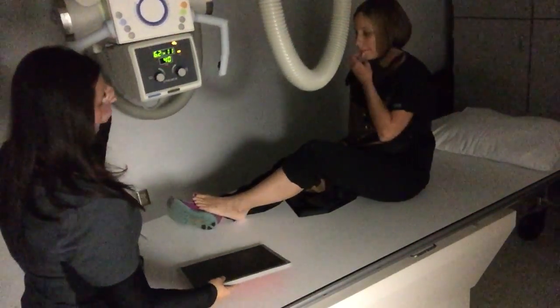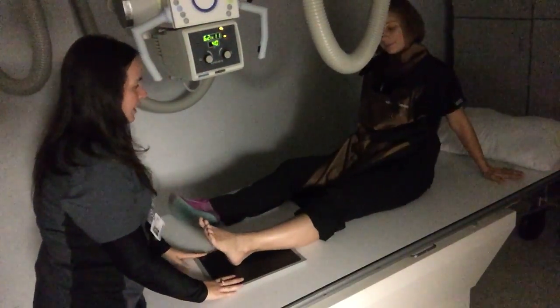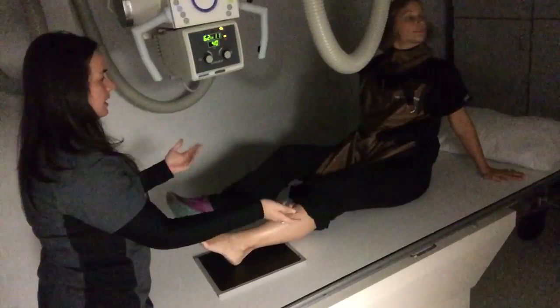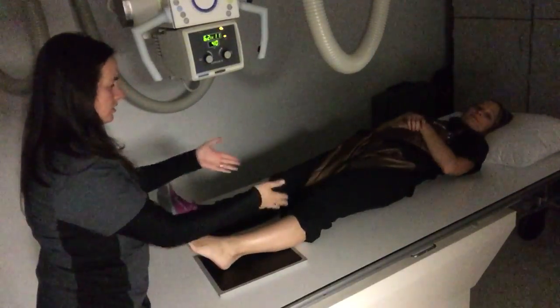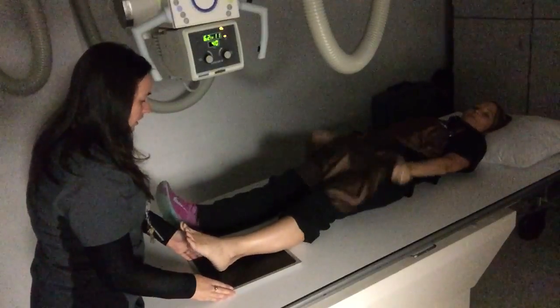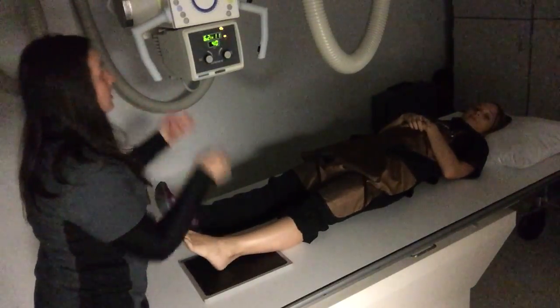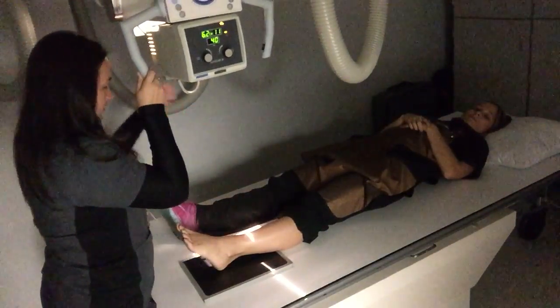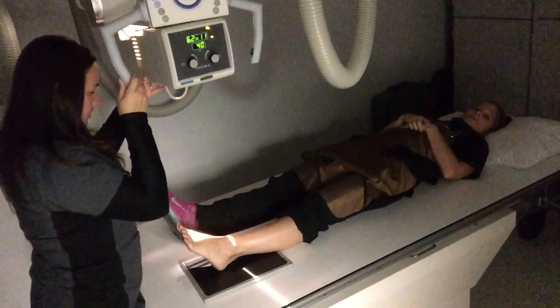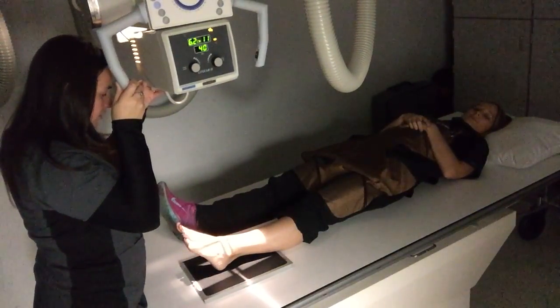So I'm going to have her just rest her leg out straight here. Typically, I have my patient just go ahead and lie down because it's easier for me to help manipulate their leg if it's just straight. So I'm going to position her ankle right in the center of my plate here. I'm going to use a 40-inch SID. And we're going to start with this AP projection. I'm going to come right over the center of her ankle.